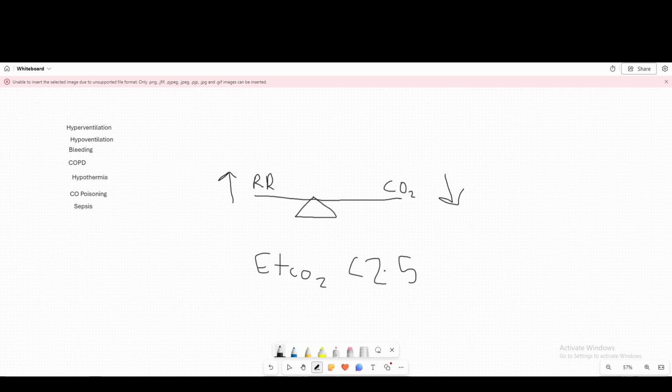And if we know anything about alkalosis from the curve that I was showing you earlier, this is going to cause oxygen to bind very, very tightly to hemoglobin. And it's not going to want to release from the hemoglobin, right? So your lungs are going to take in a large amount of oxygen and store it in your blood. But once it actually gets to your tissue, it's not going to get that oxygen, right? So your tissues are going to become hypoxic, but your blood is still going to be saturated with oxygen. So you can have a falsely high reading when you're hyperventilating, right? You can have a really high SpO2, but you're actually experiencing tissue hypoxia.